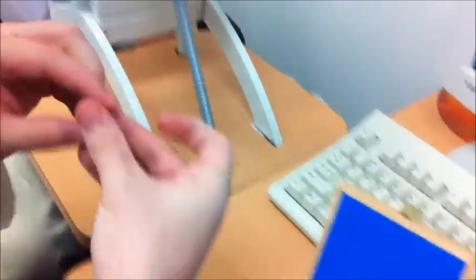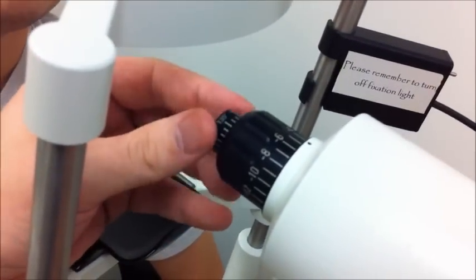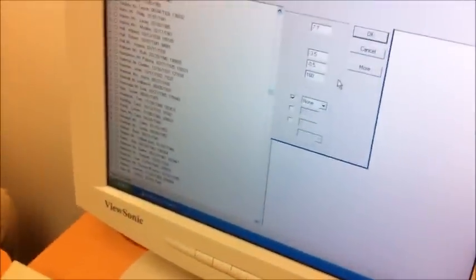You would take this out, and there are axis markings on the lens. When you put it on, there's a white mark on the top and you would just adjust it to the axis. But for this case we don't need that lens, so we'll leave it in the box. When we hit OK, it's going to take us to another screen.